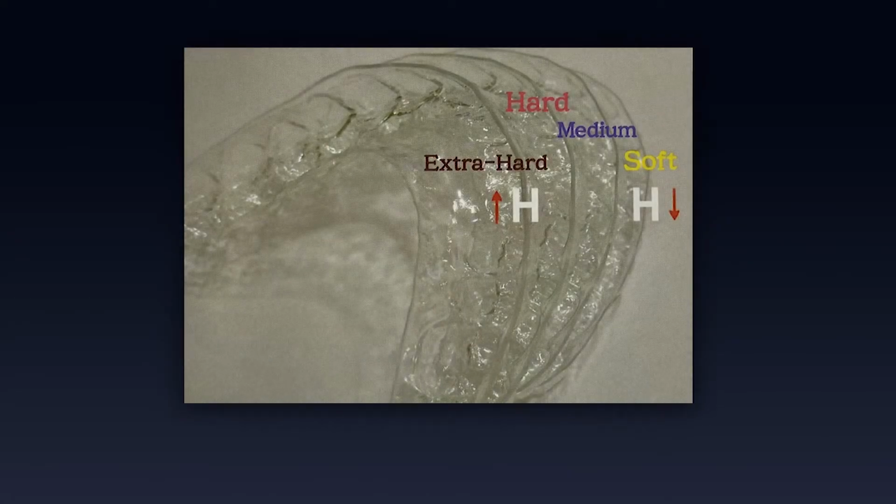There are 3 sheets for general clear aligner treatment. Soft equals 0.500 millimeters. Medium equals 0.625 millimeters. Hard equals 0.750 millimeters. Thicker sheets are not used for clear aligners because they cause temporomandibular joint failure.